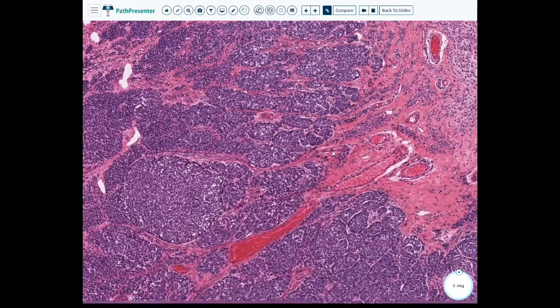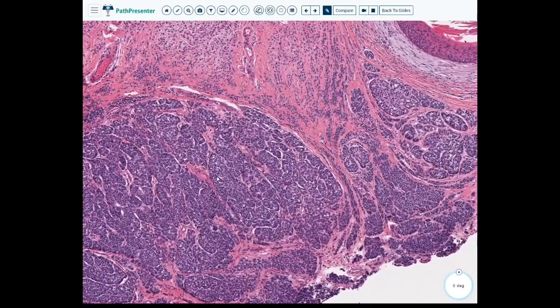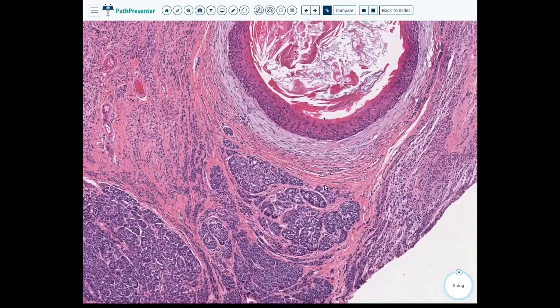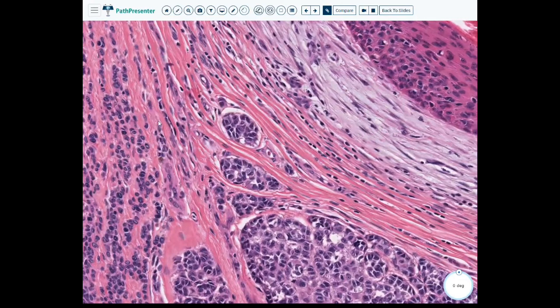And again, this blueness, right? So remember, one of our features of maturity is that this should be less blue as it gets deeper. It should mature. It should become more pink, and we still see that same blue, even at the bottom of this lesion. Okay? So here where our normal melanocytes are like over here, and we see that, yeah, there is some variation in size, but for the most part, they're very small.